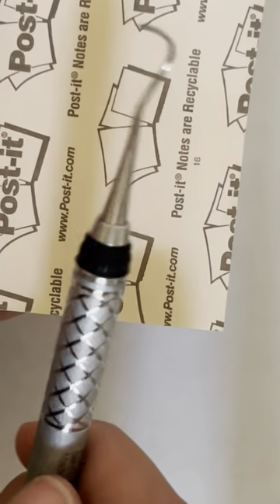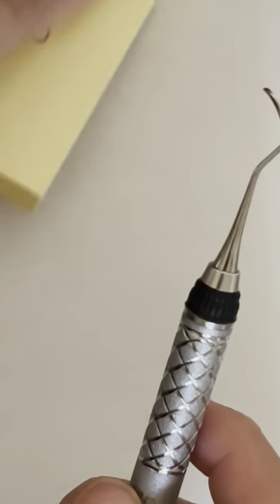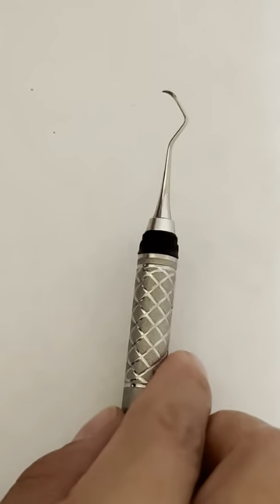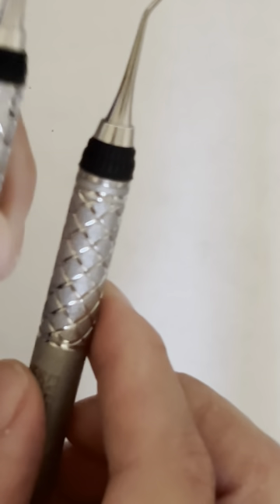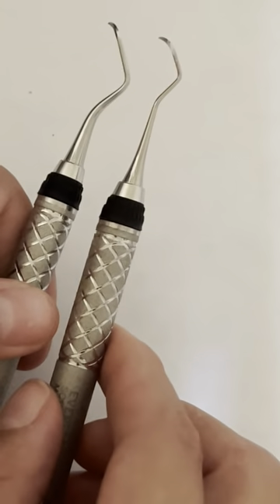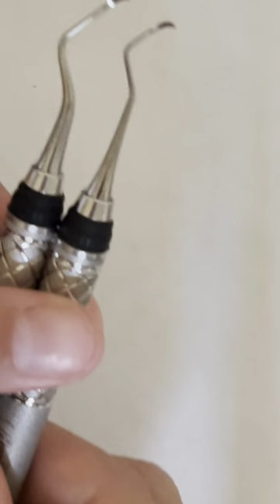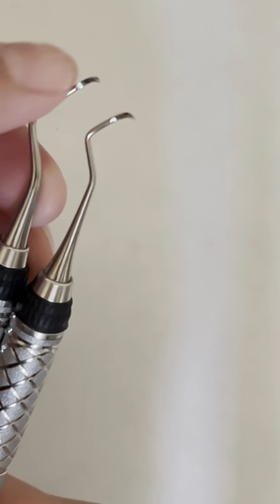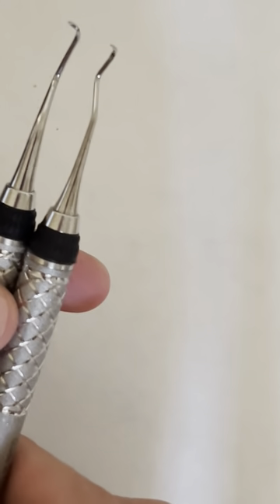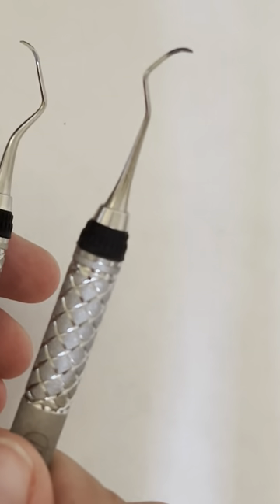Then we're going to go with our Columbia 13/14. This one is universal, but the terminal shank is smaller — see how it compares to the Barnhart? All three of these are universal scalers. The 13/14 Columbia is the smaller one, while the Barnhart looks a little bit bigger.